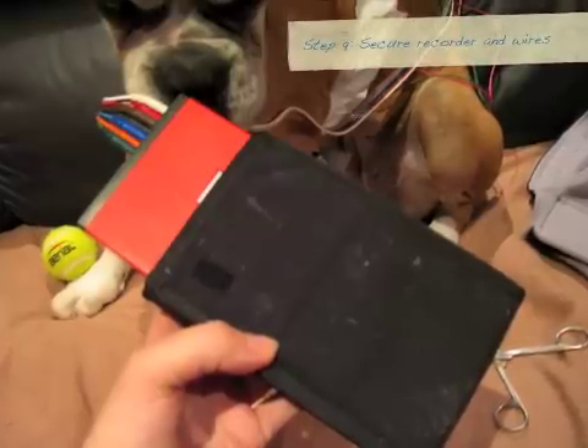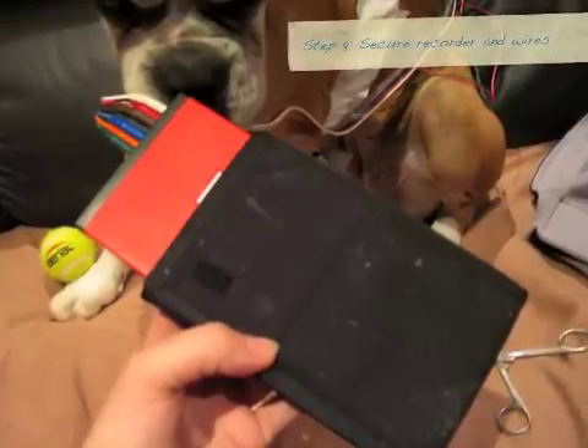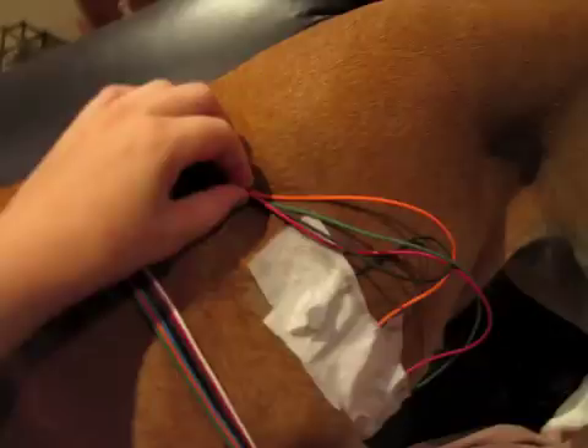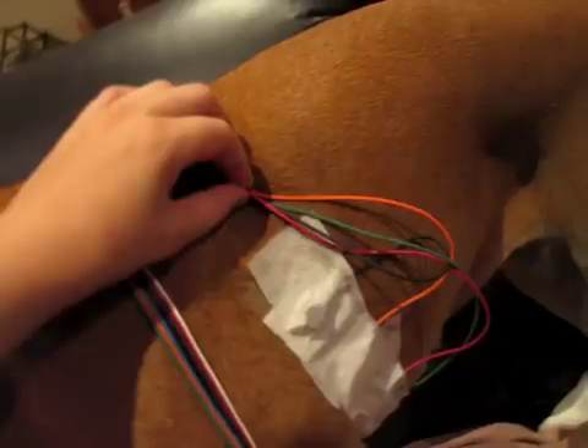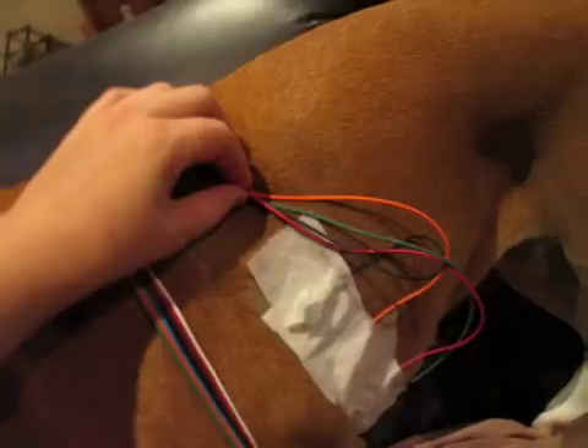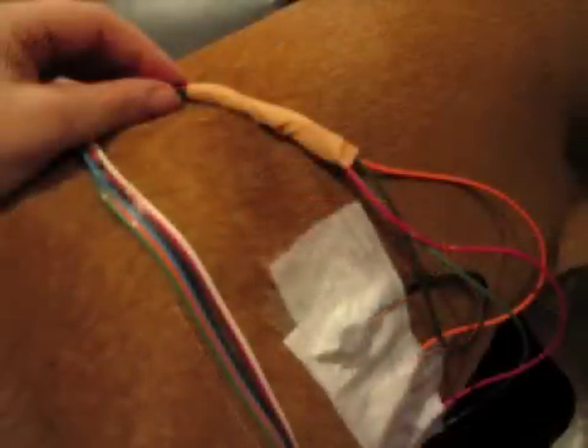Now I need to secure the recorder and the wires, so I'm putting the cover on the recorder. Not all machines come with these covers. I'm just securing the wires a bit to keep them tidy and make it a bit easier to avoid them getting caught on anything. I just use a bit of sports tape around the wires to keep them tidy.